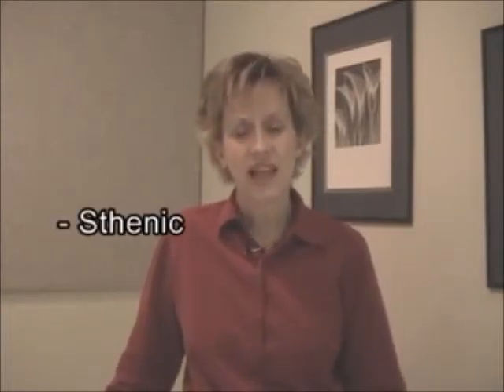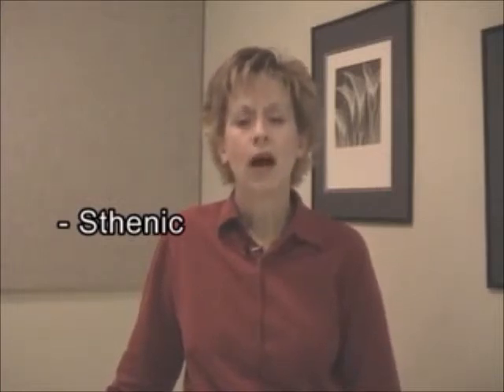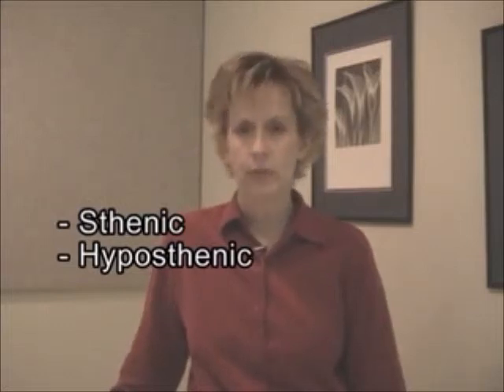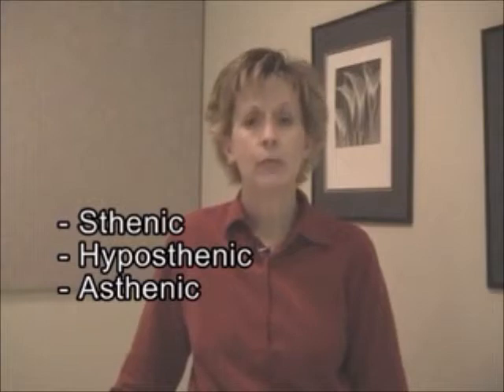So not only are you going to be dealing with different scenarios, it's patient habitus that is going to be probably your biggest challenge. Our 4 categories of patient habitus: sthenic, that's the average patient build. You have hyposthenic, which is a smaller than average build. You have an asthenic build, which is very tiny or very petite, especially if the patient's elderly.